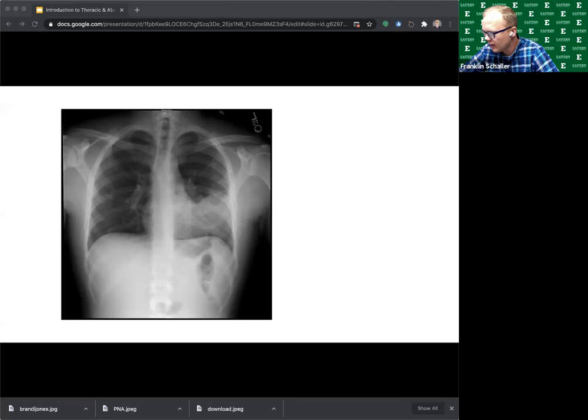All right. So, Tina, maybe a bilateral lower lobe pneumonia. Christina, pericardial effusion. So, when I am assessing the left border of the heart here, I don't know about you guys, but I do not see a distinct border of that left side of the heart there. So if I'm putting this in conjunction with the clinical history, maybe this patient has cough, fever, shortness of breath, exposure to COVID-19. Here we see a left upper lobe lingular infiltrate. And there's, again, pretty obvious loss of that left heart border.